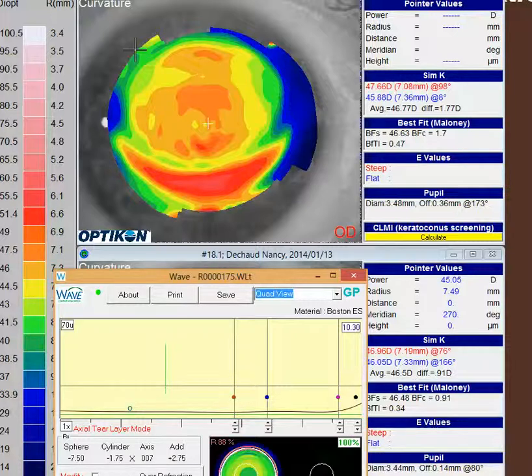Maybe get a quick measurement of a known spherical RGP over the cornea with a known base curve so I can adjust my over-refractions using that trial lens data tool. I'll reference that in a moment and then they can wear their contacts while I'm designing their lenses. Now if that's not possible then we kind of have to work with what we have to work with.